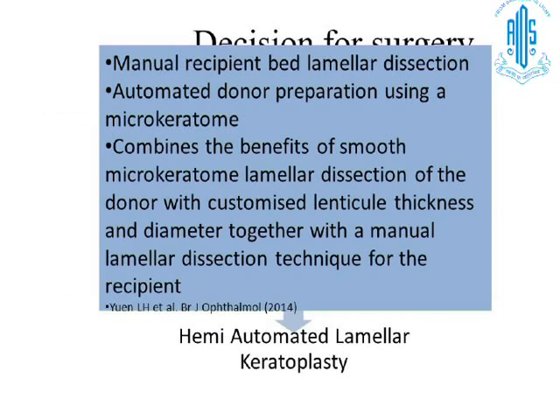So there's manual recipient bed lamellar dissection and automated donor preparation, so it combines the benefits of a smooth microkeratome lamellar dissection of the donor with the customized lenticule thickness of the host.